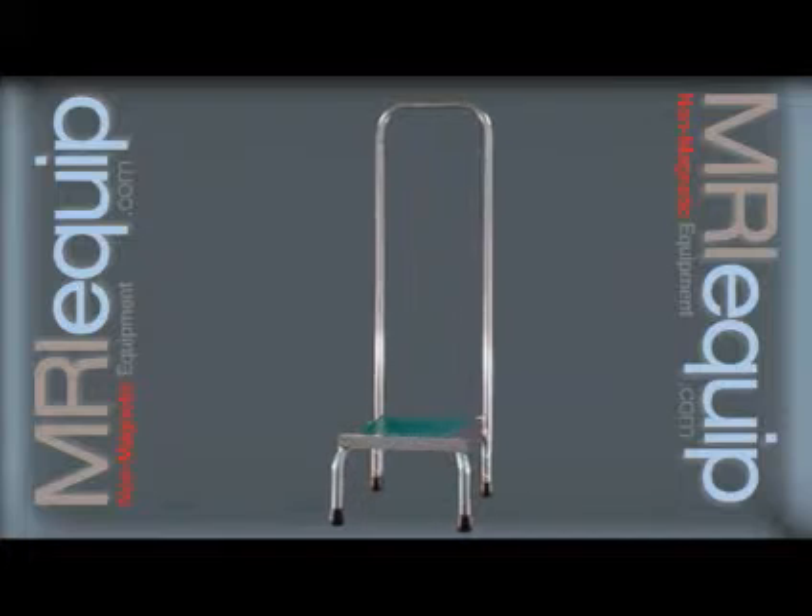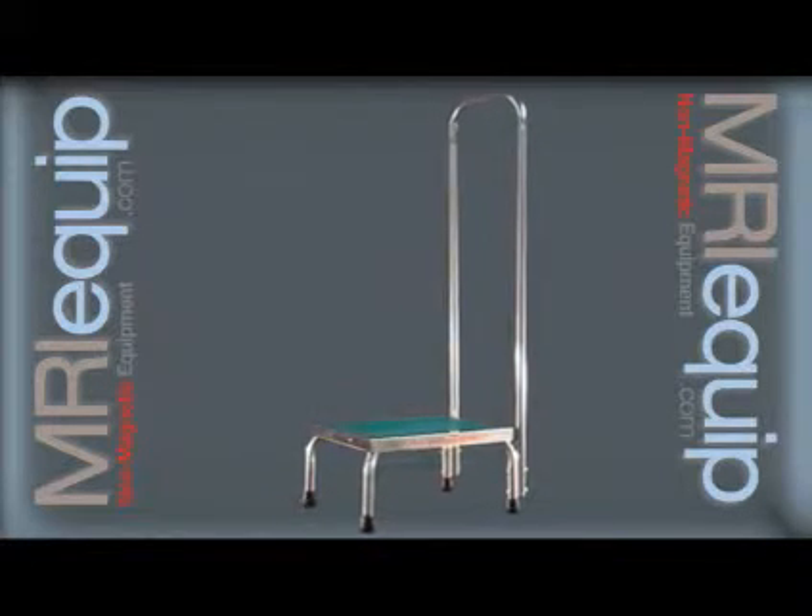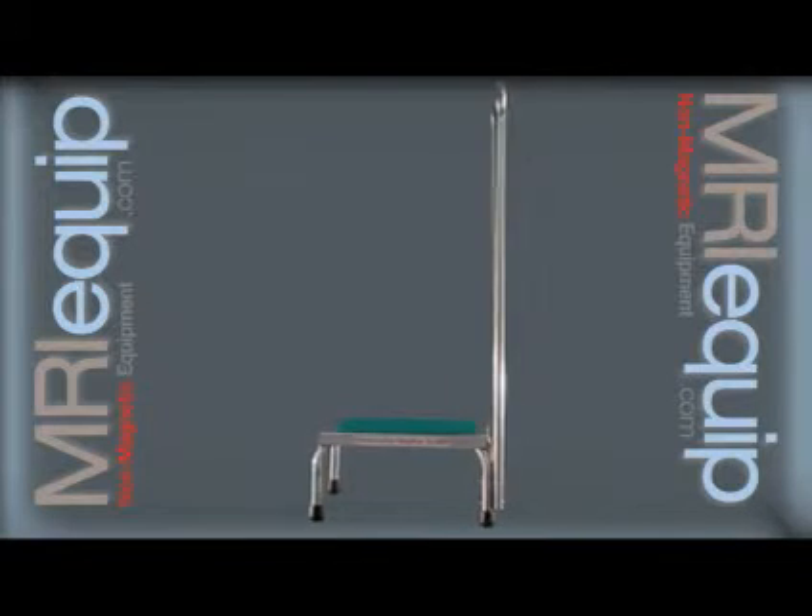This MRI non-magnetic step stool with a single 41 inch handrail has many uses. Made from stainless steel, it is sure to be long lasting and stand up to wear and tear.